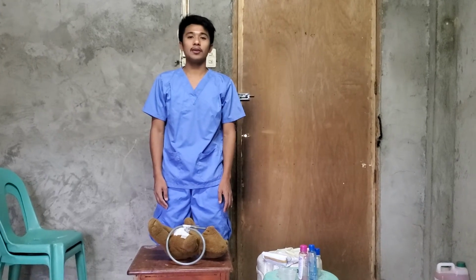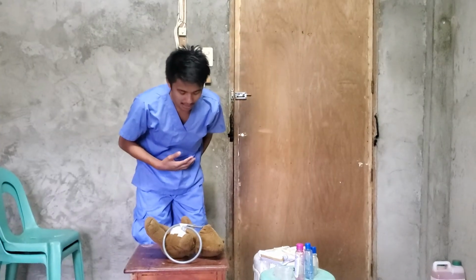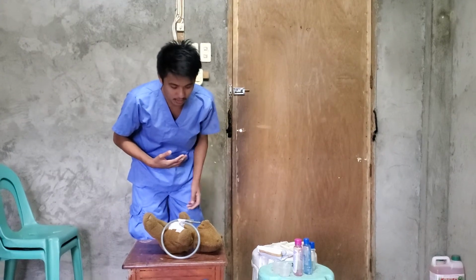Performing administering medication through a feeding tube. First is introduce your name and identify the patient. Hi ma'am, I'm Harley Gama Jr. I'm a student nurse and you are?